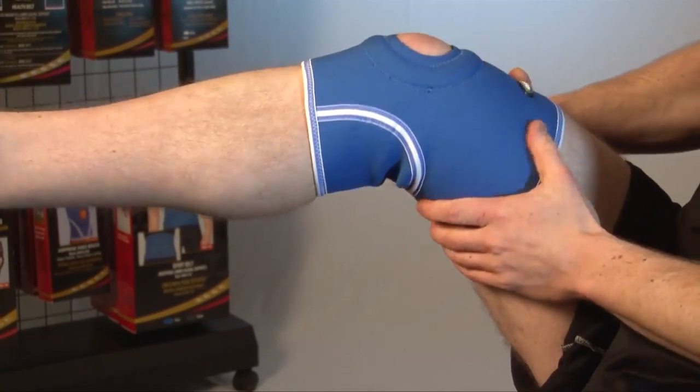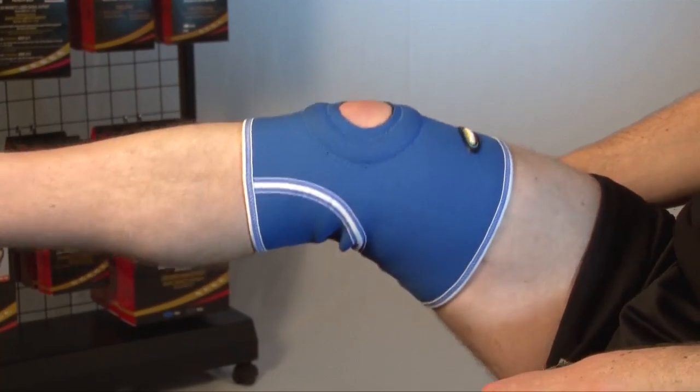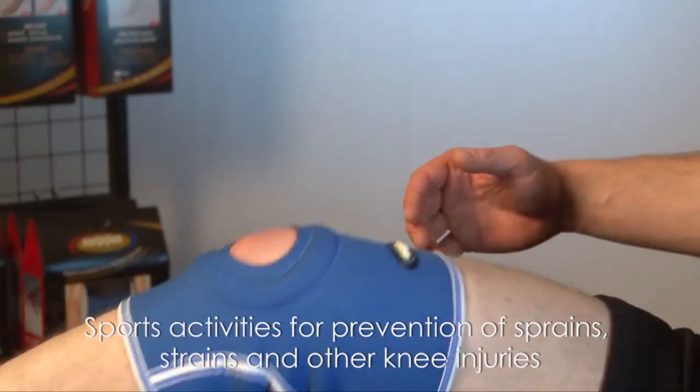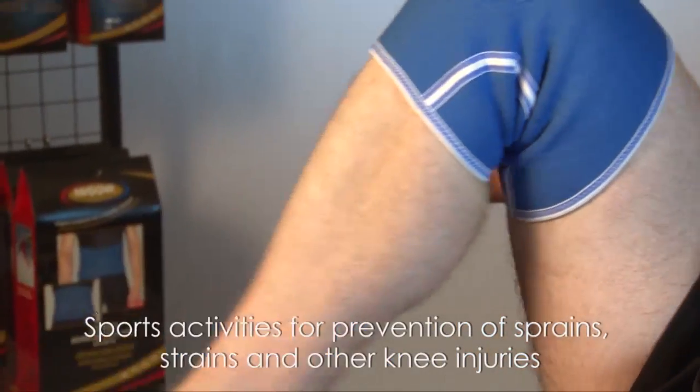It has been assigned HCPCS code A4466. This knee support is recommended by doctors for sports activities for prevention of sprains, strains and other knee injuries.